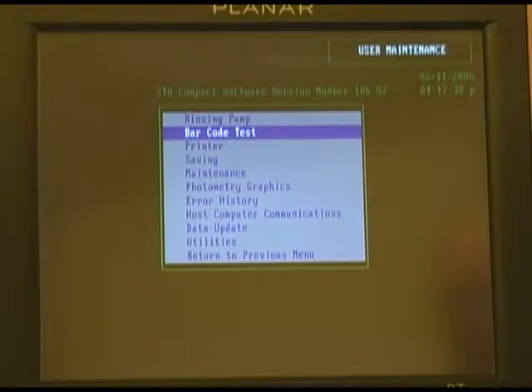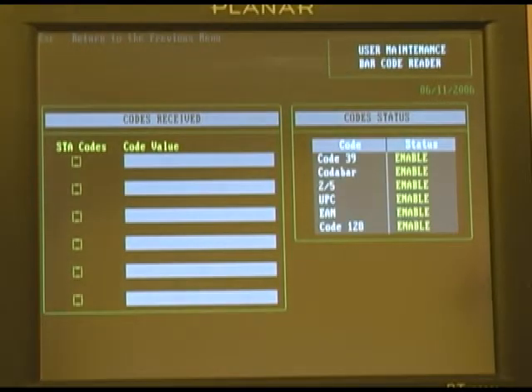The next option we'd like to cover is the barcode test. This will allow you to verify your patient sample barcodes. If you find that the instrument's having trouble reading them, you can come here, scan the barcode, and see whether or not the instrument is having a problem with your barcode or whether or not it's a configuration or setting error. Just take your barcode, scan it, and it should display the values on the screen. Compare the numbers that are displayed against the numbers on your barcode label to determine whether or not there's a configuration issue or a read issue.